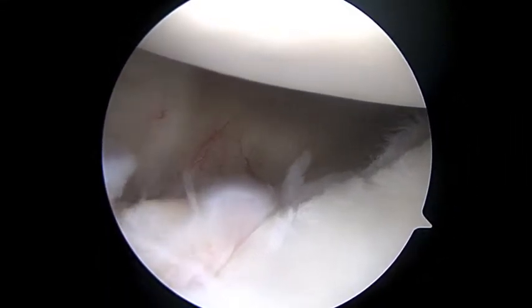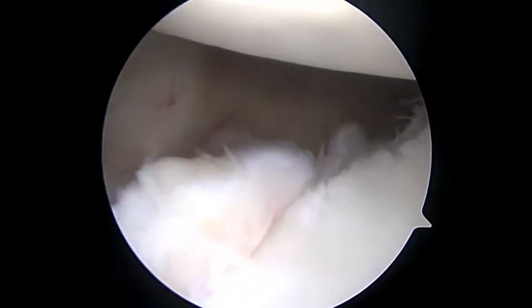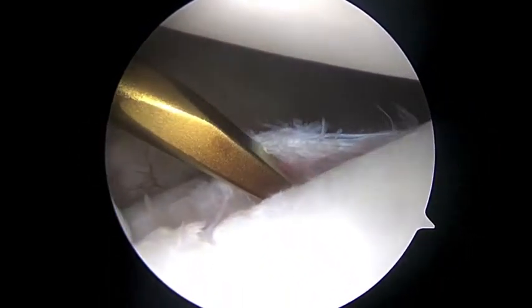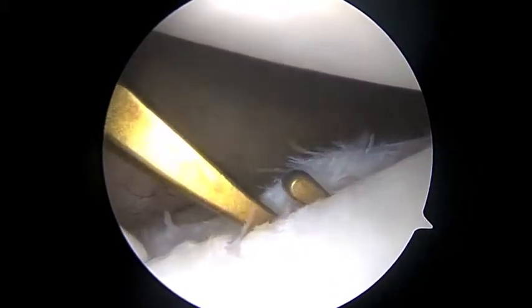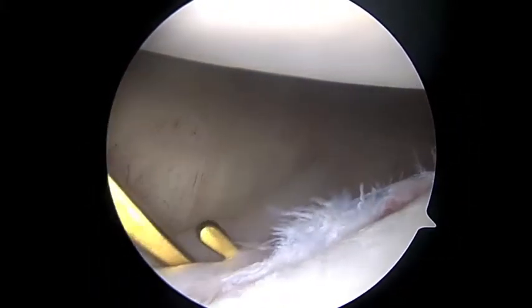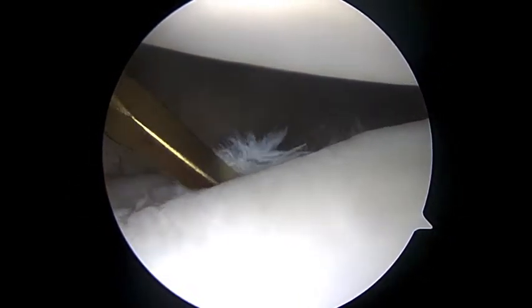We'll look down the front of the shoulder and you can see this instability. You can see this Bankart lesion in the front. This is all not normal — not only is it torn, but it's pushed down, medial. It should be sitting up high on the rim of the glenoid, and it's not. There's really not much definition in this anterior glenohumeral ligament, anterior band of the anterior glenohumeral ligament.